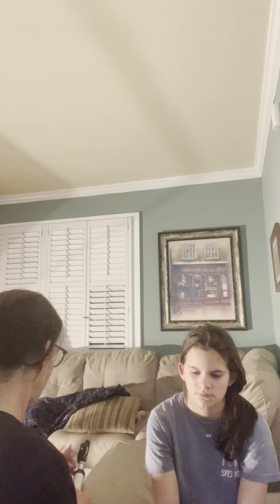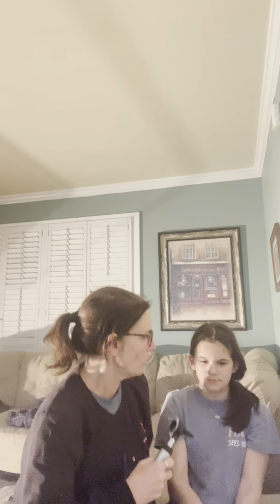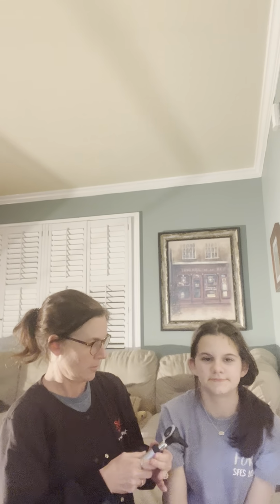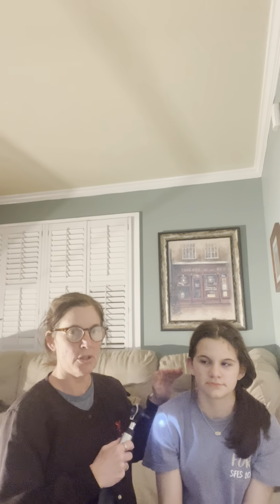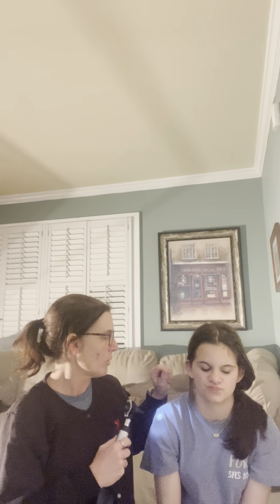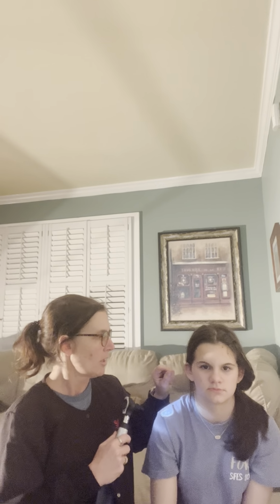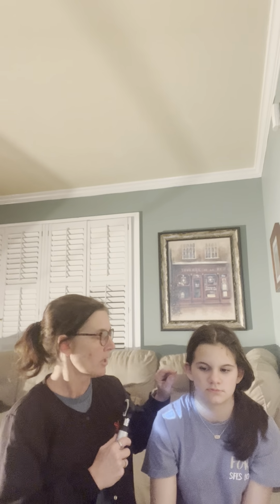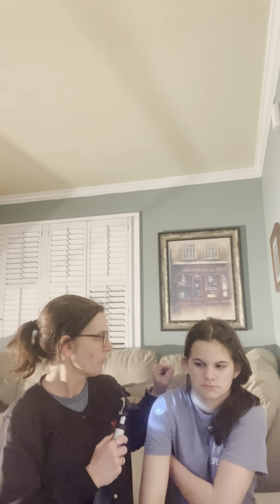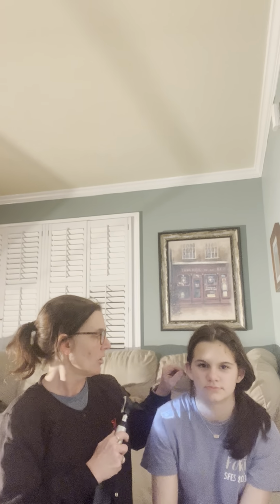and then I will take my scope and I will look into her ear. As I'm going in her ear, I'm going to be looking to make sure that there are no scrapes, if there's any wax buildup, if there's any redness. When I look into her inner ear area, I will notice that it is gray and pearly in color. I will also see the bony landmarks in there, and then I will also see the reflective light if it is normal. And I would document and report these findings.